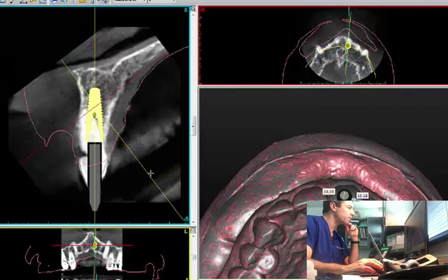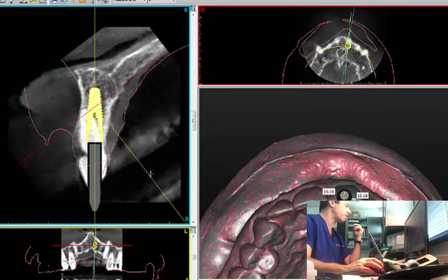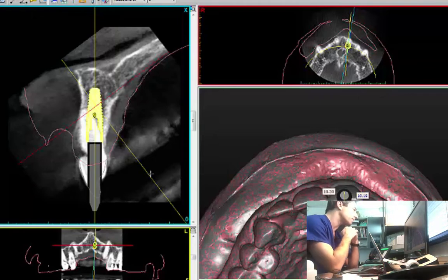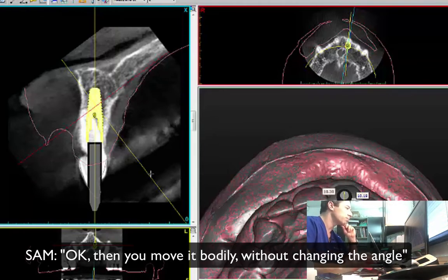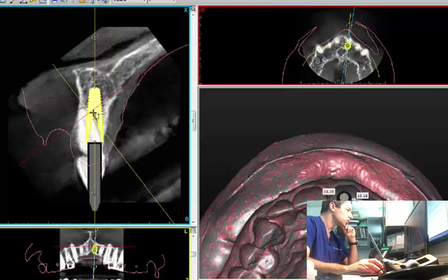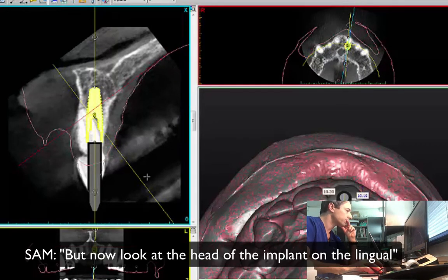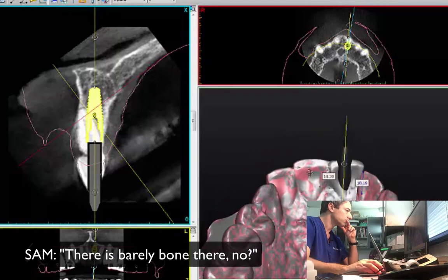How about if I move it a little bit to the palatal, just a little bit? I actually have better bone engaging to the palate. Then you move it bodily — without changing the angle, just moving it bodily. But now look at the head of the implant on the lingual side — there's barely any bone there.